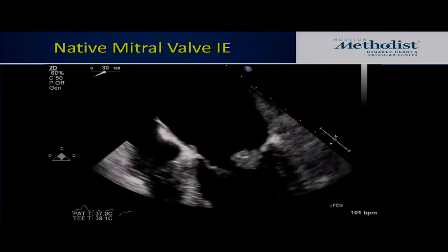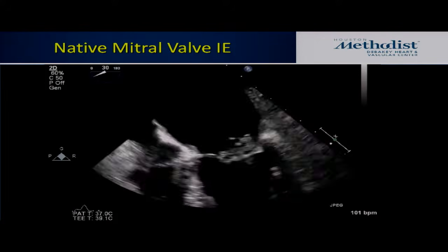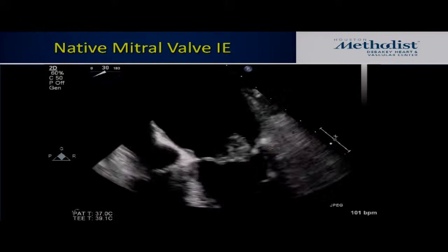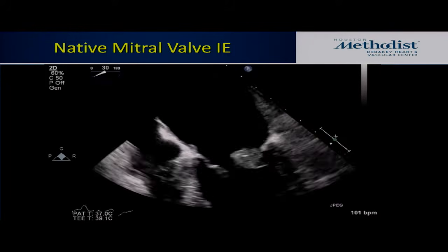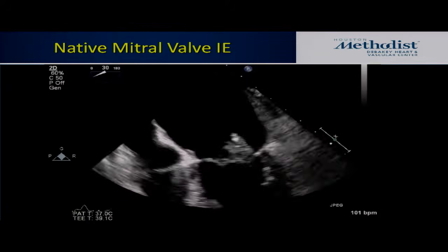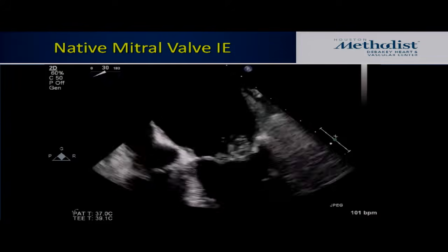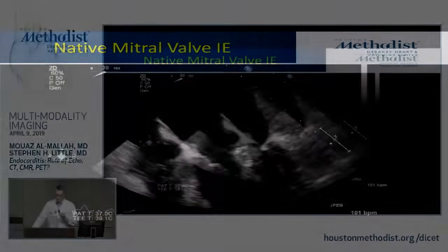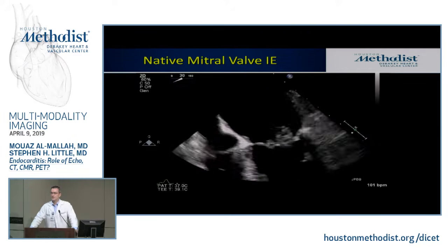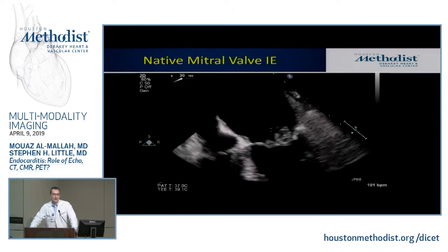So that basically means that it's not moving synchronously with the valve or the cardiac cycle. It has kind of almost like a flag in the wind effect, which is oscillation. Most malignancies don't necessarily do that. Again, there aren't hard criteria that you can always bank on, but like a lot of what we do in the quantitation of regurgitant lesions, you increasingly build your data. You want to see a veggie on the flow surface. You want it to be oscillating.